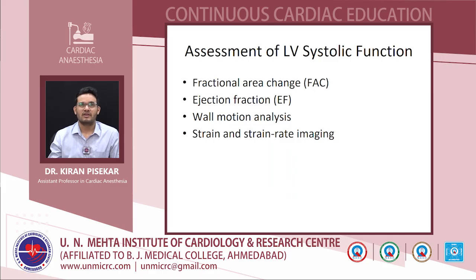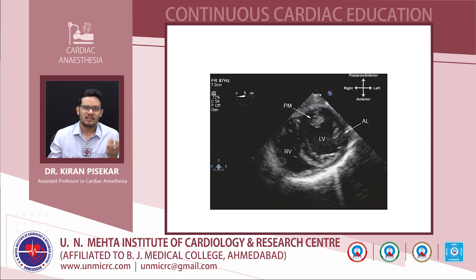Assessment of left ventricular systolic function uses fractional area change, ejection fraction, wall motion analysis, and strain and strain rate imaging. These modalities have been discussed in previous classes, so we'll not go into much detail. This is a transgastric mid short axis view showing the RV and LV. In this view we can assess the LV filling.